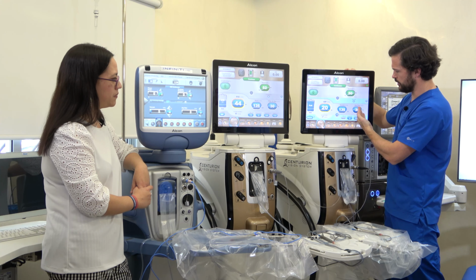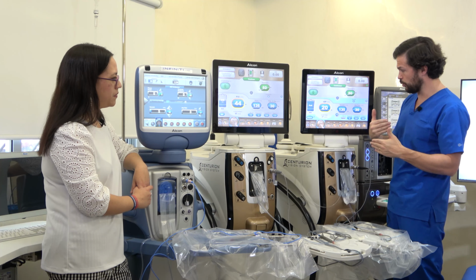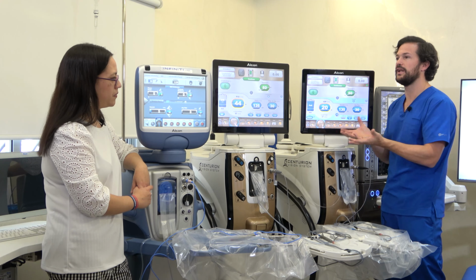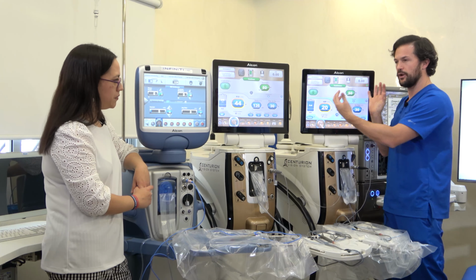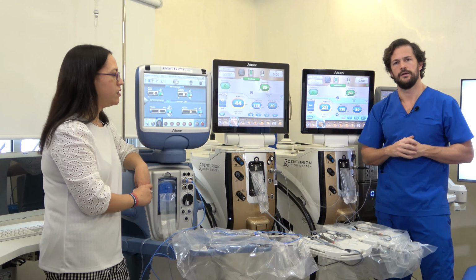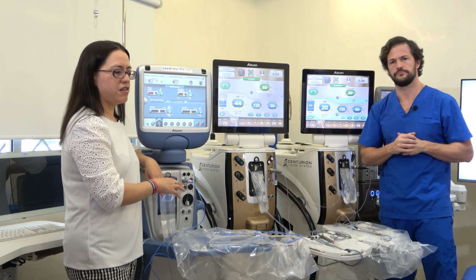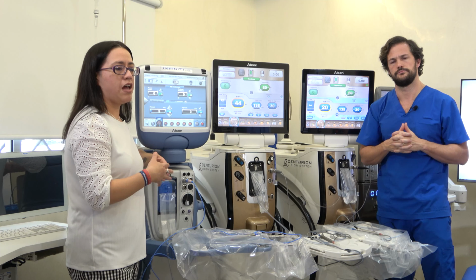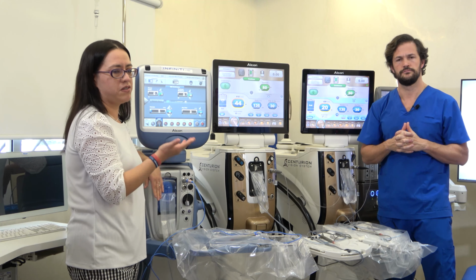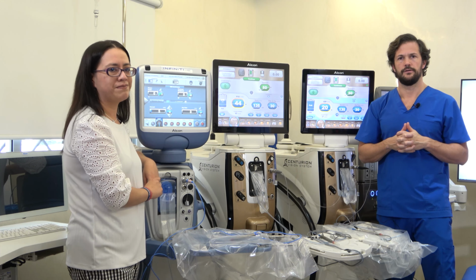Again, one very important concept is, since you want the machine to work correctly, you're going to put a vacuum of 135 and aspiration flow of 30. That's higher than what comes from the machine, that's coming from Infinity, right? So the tubing of the system is a little bit different. To have the pump working properly and efficiently, we move the vacuum to 135. It's a little bit of an increase, but it's going to be good enough for you as a starting point.